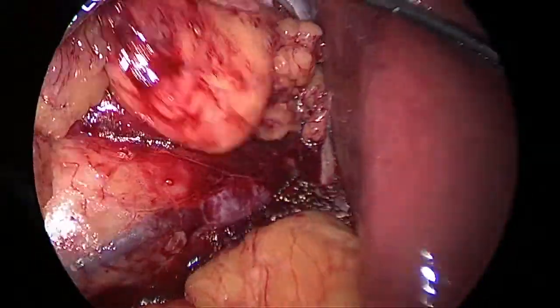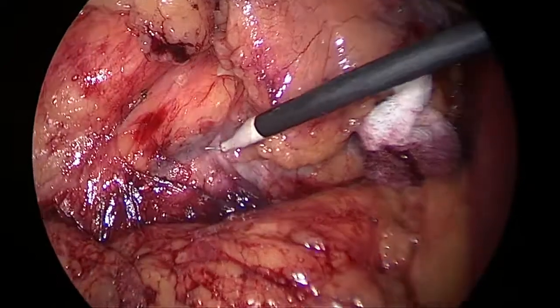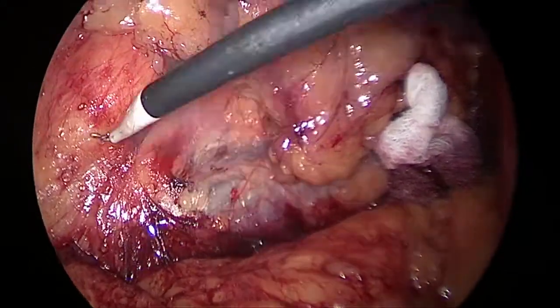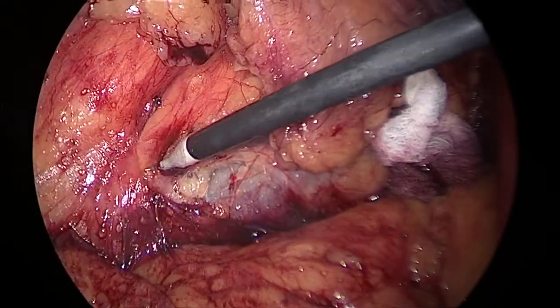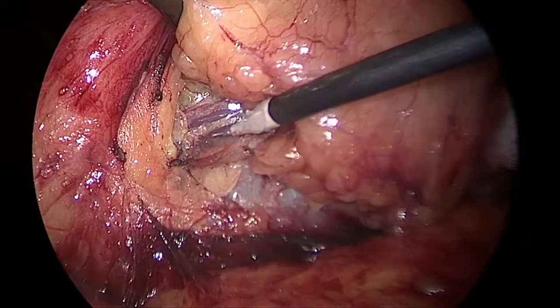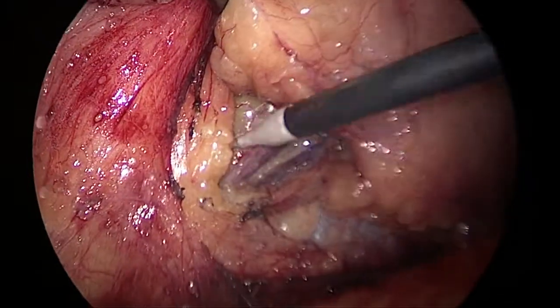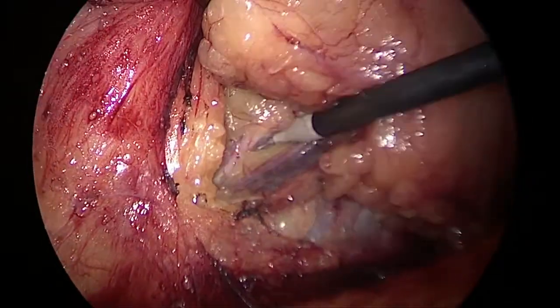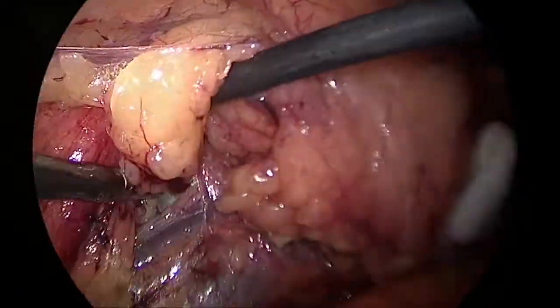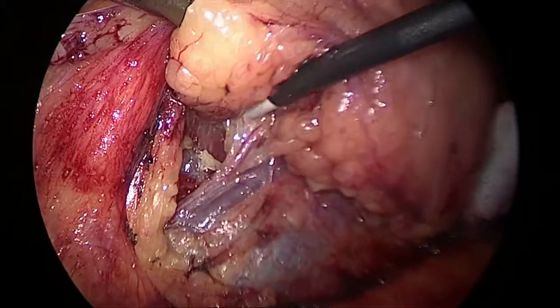I open the gerota's fascia at the level of the lower border of the lower pole of the kidney, where the gerota's fascia is usually thin. In this case, as it is not a case of radical nephrectomy, I will leave the gonadal vein medially. I will go lateral to the gonadal vessel. Instead of elevating the gonadoureteral complex, I will just elevate the ureter along with the surrounding fat. Here I am incising the gerota's fascia and trying to expose the psoas muscle, which is another important landmark for doing laparoscopic nephrectomy. Now you can see the psoas major muscle.